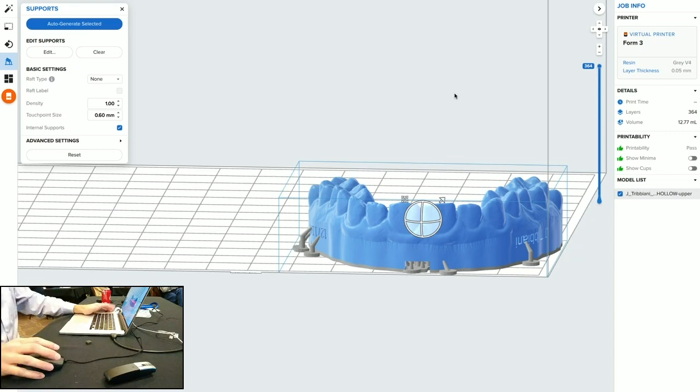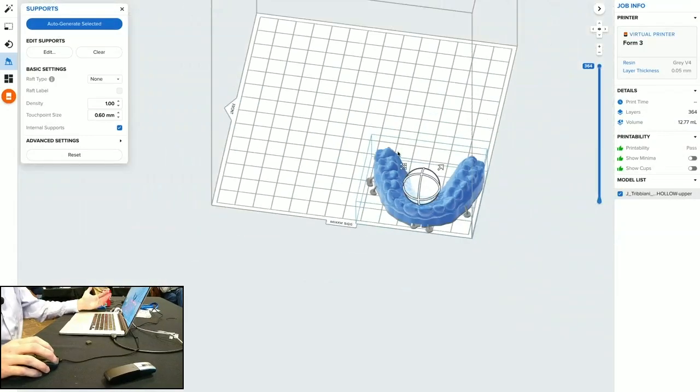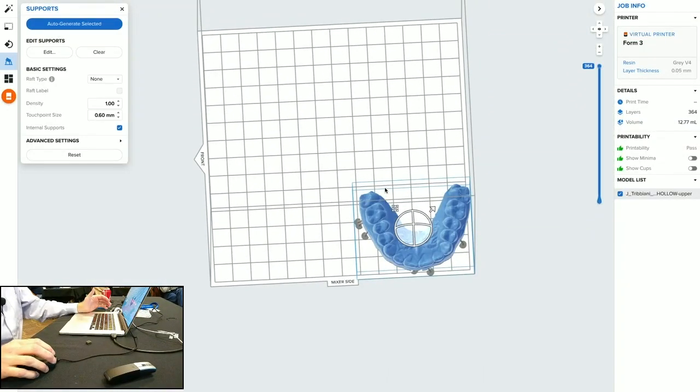And you're doing six of them. Six fit on here easy. I've done 8 before. I think that's the most I've done. But it definitely depends on the size of the mouth. You get some huge horse people in there, it's going to fill up the whole plate. But you get little kids that have braces, you can fit a lot more.